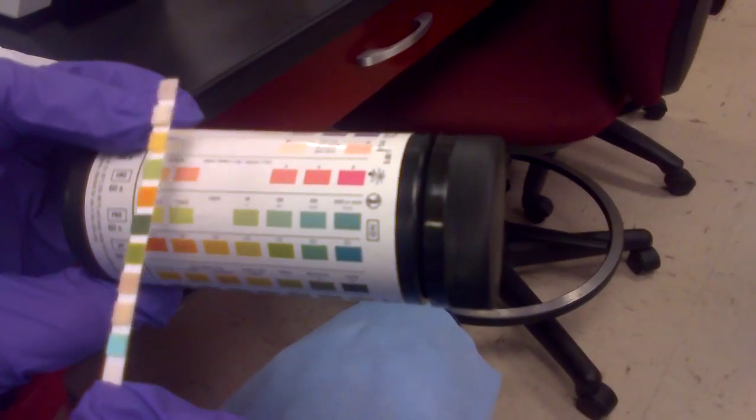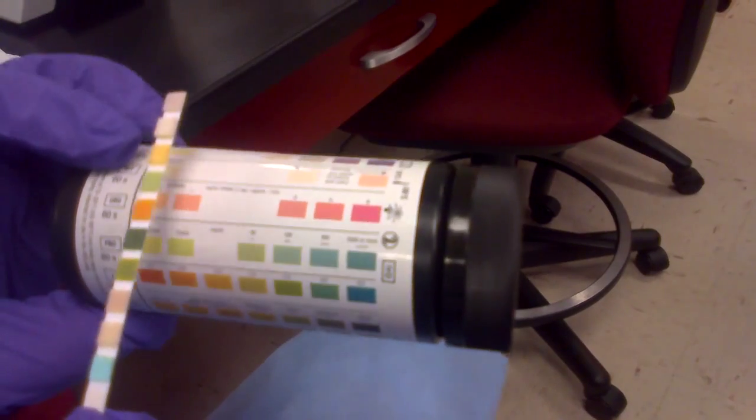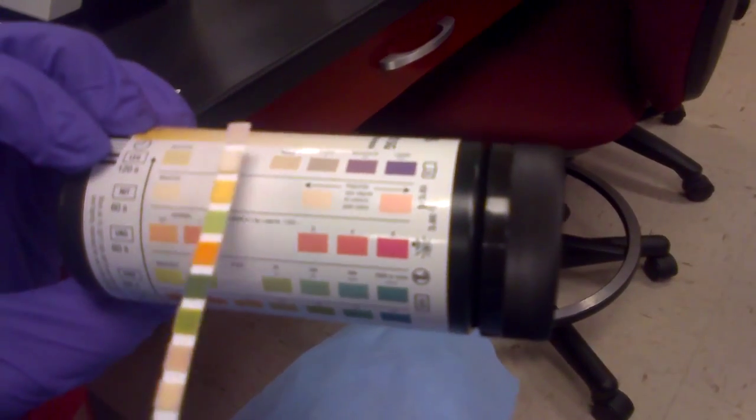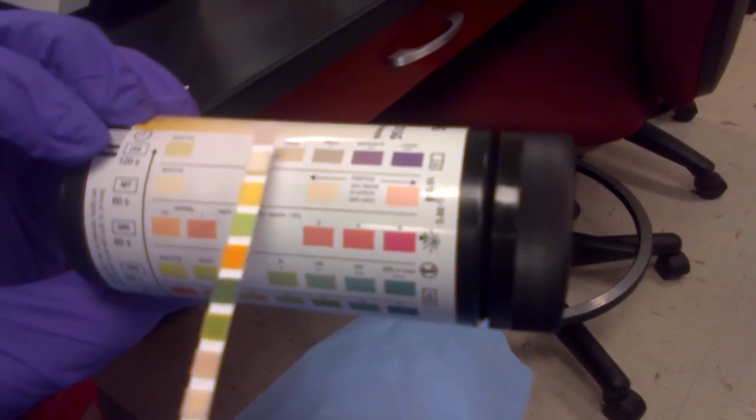Urobilinogen is next, and we have just a normal amount. We have a negative for nitrite and a trace of leukocyte esterase.